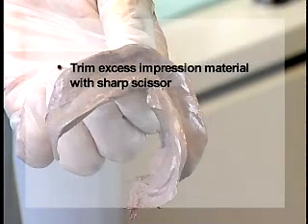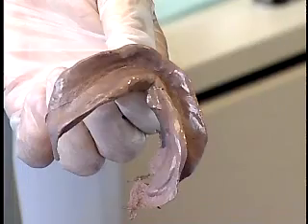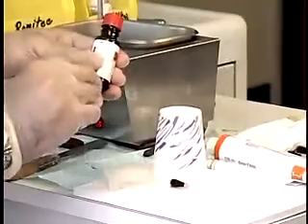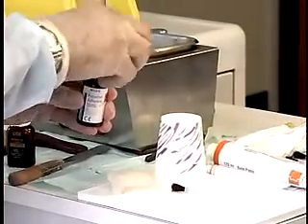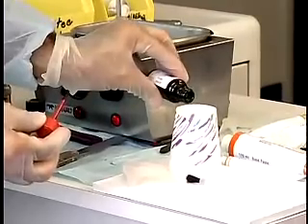Using a sharp scissor, trim the excess impression material. Remove any unsupported impression material which would distort when the impression is poured, especially in the lingual flange area. Paint the borders of the tray with elastomeric impression material adhesive and wait until it's set.